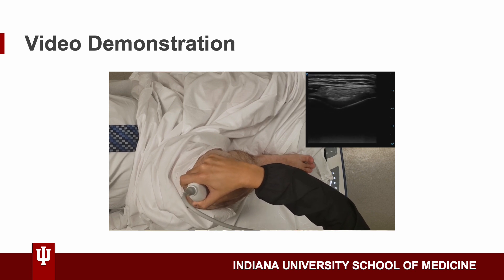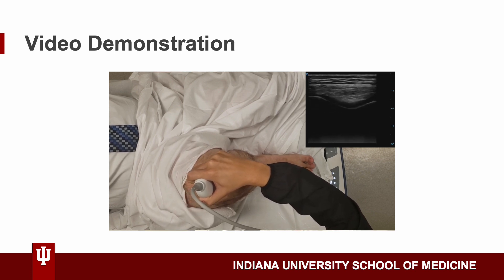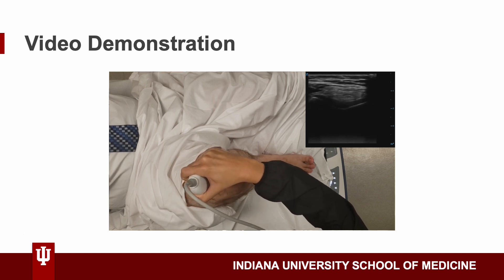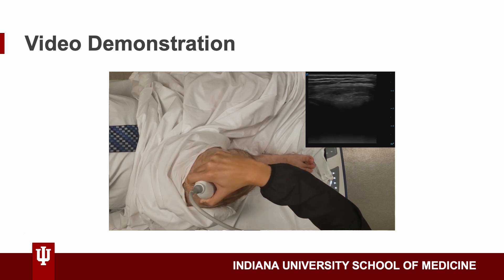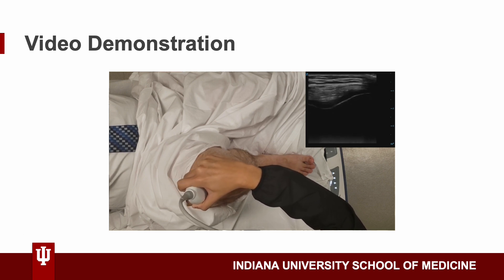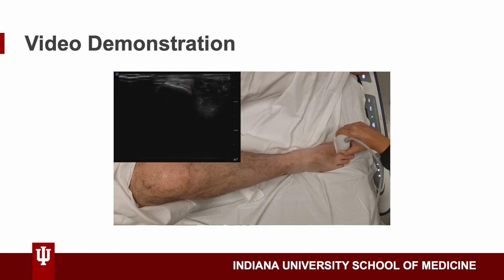Here's a video demonstration of how to use POCUS on the knee. This is me using the linear probe to scan the knee. It's important to find all the angles and look for the findings covered in the next slides. Here's another one for the toe — again, emphasizing the importance of scanning all angles to make sure nothing is missed.